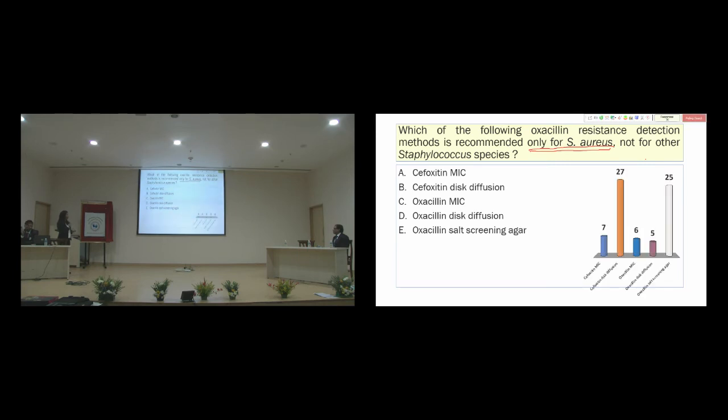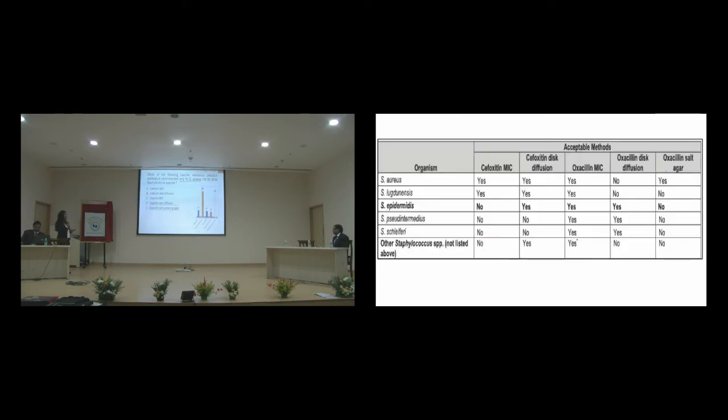So what is the answer here? Answer is oxacillin salt screen agar. There is a table included in CLSI 2019 that gives the acceptable methods for detecting resistance for all these Staphylococcus species. You can see the methods mentioned here: cefoxitin MIC, cefoxitin disk diffusion, oxacillin MIC, oxacillin disk diffusion, and oxacillin salt agar.